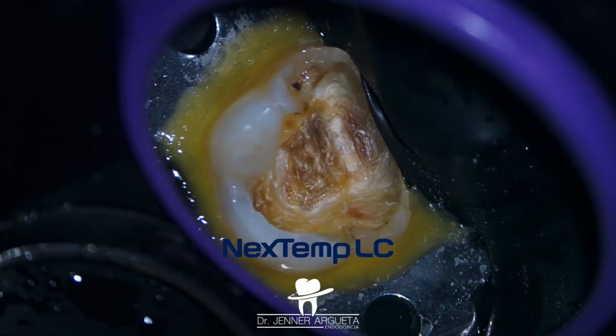One of the first things that we need to understand is that proper isolation will allow us to maintain that treatment and that tooth free of contamination. Most clinicians around the world are used to placing a clamp and using a rubber dam, but I like to add a flowable dam all around the clamp and all around the tooth. In this case, I like to use NexTemp LC.